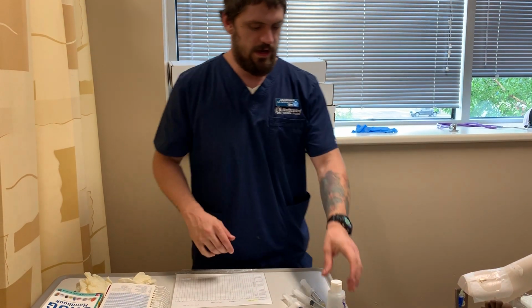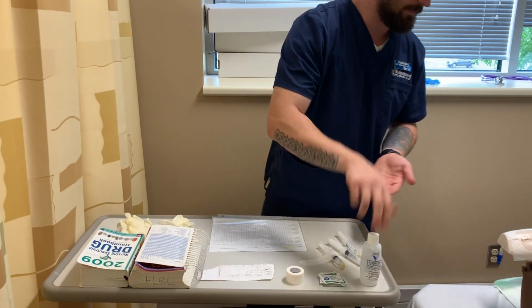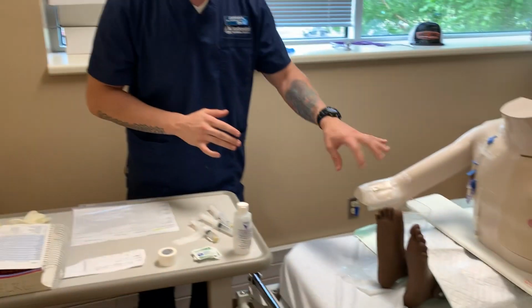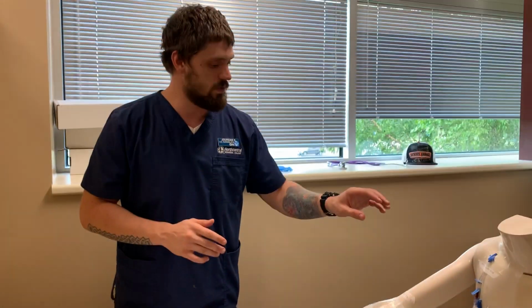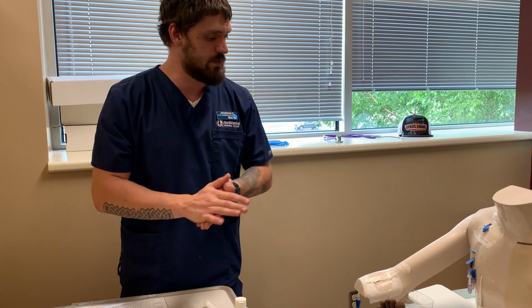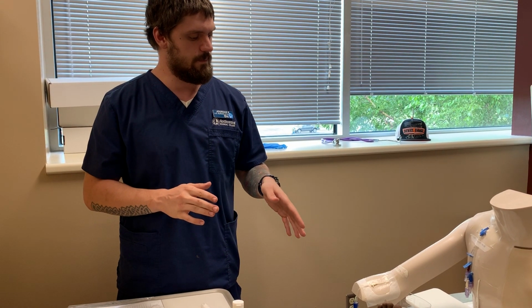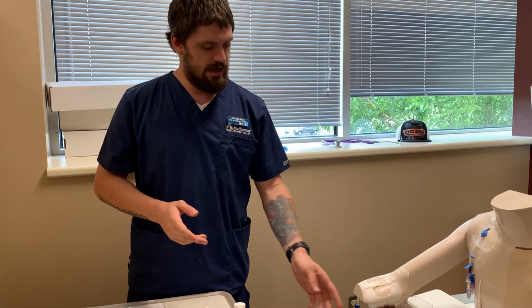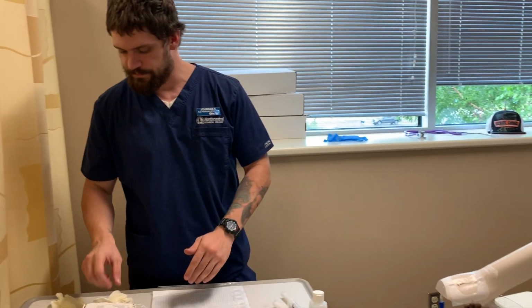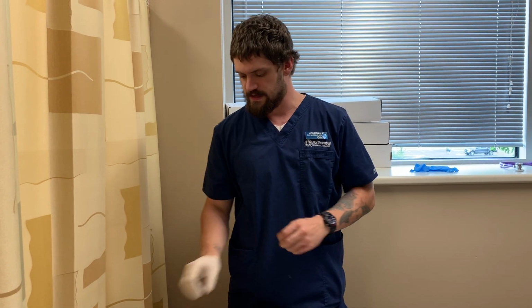Okay. We are going to now check. I'm going to wash my hands again. I'm going to take a look at the site and just note that there is no redness, edema, ecchymosis, or drainage, and the approximation is appropriate here. There are no signs of infection, infiltration, or phlebitis. So we are okay to use this. It is clamped. We have a cover on it. So I am going to wash hands again and then put my gloves on.